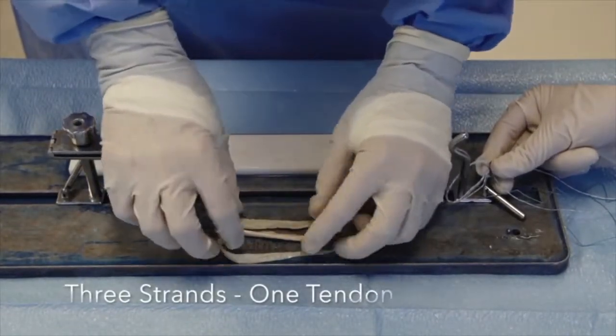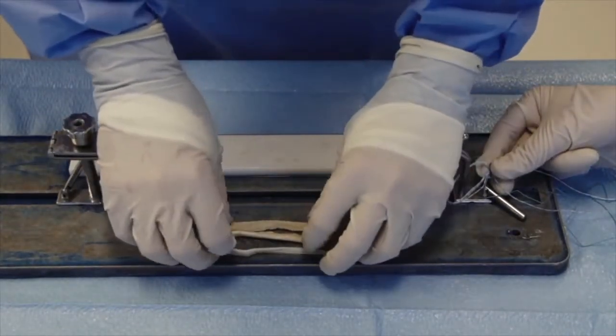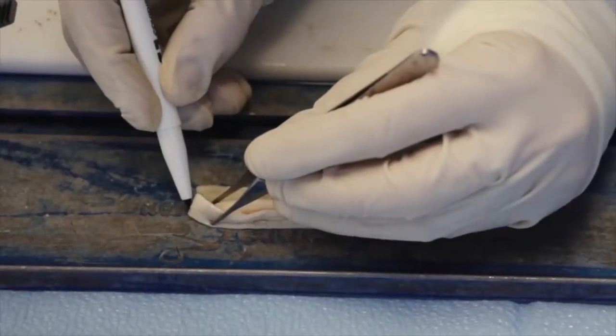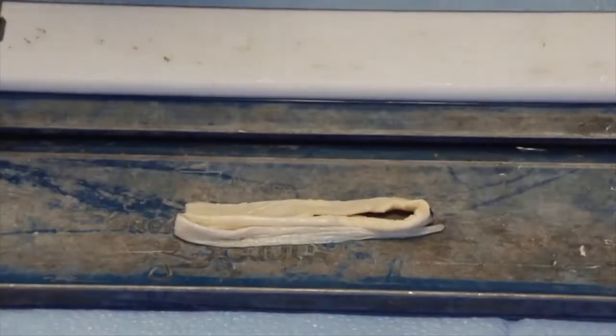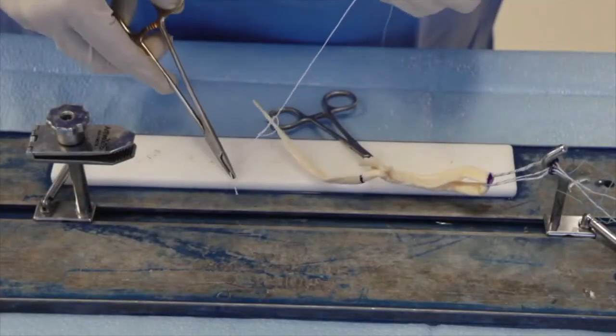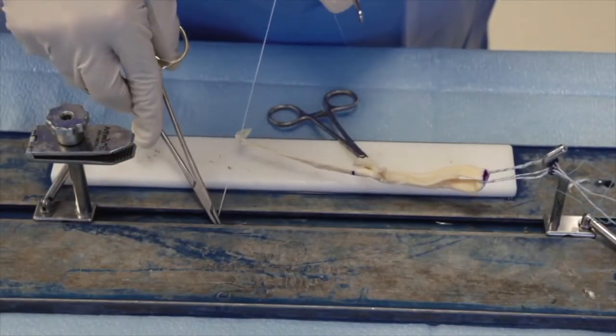We will demonstrate the three strand technique with one tendon. The tendon is folded into three equal parts and the junction at each fold is marked. The tendon is loaded into a suspensory device at one of the marks.